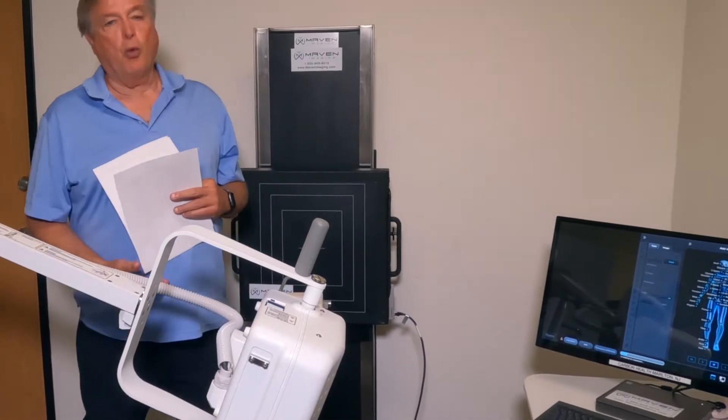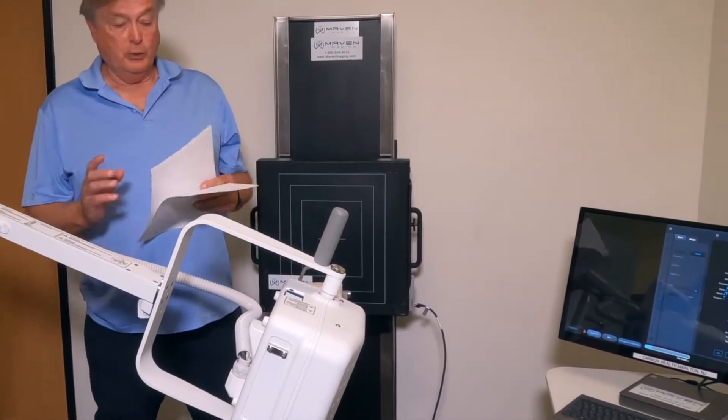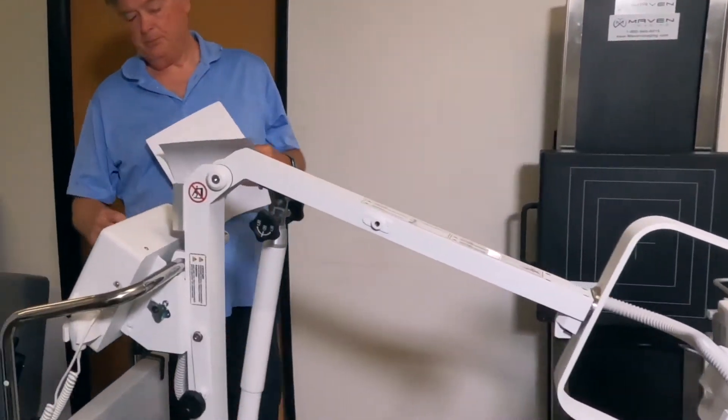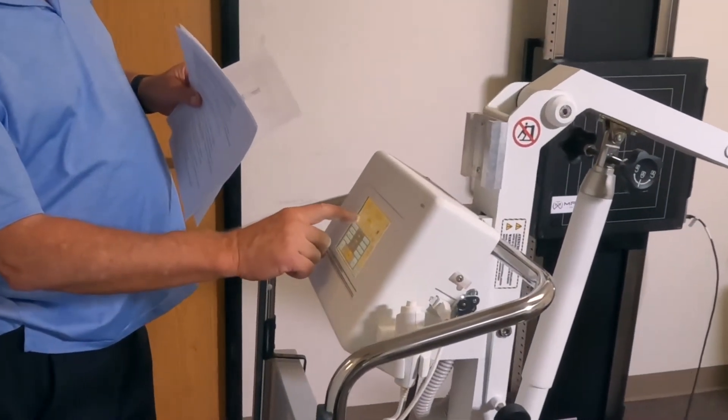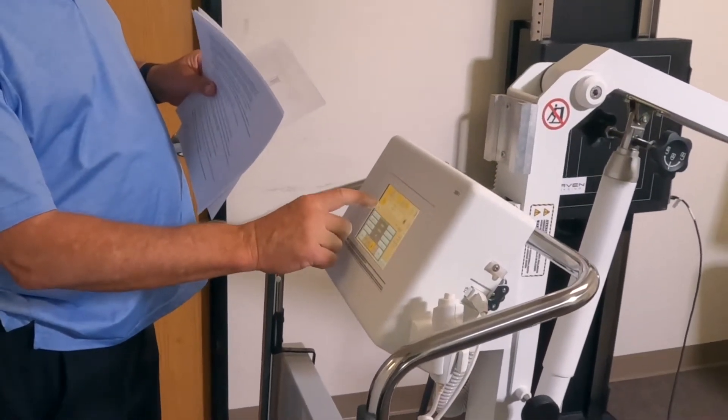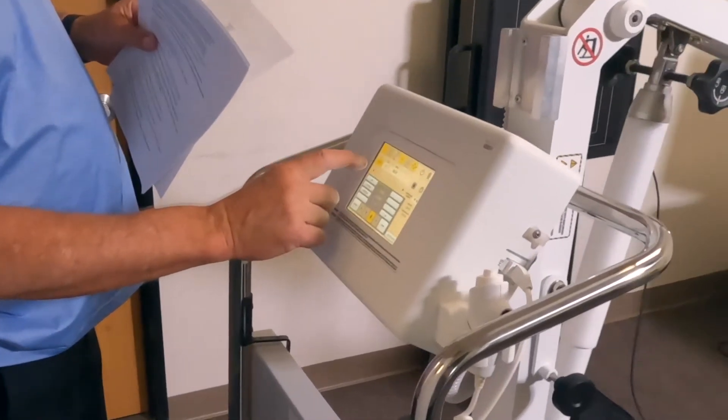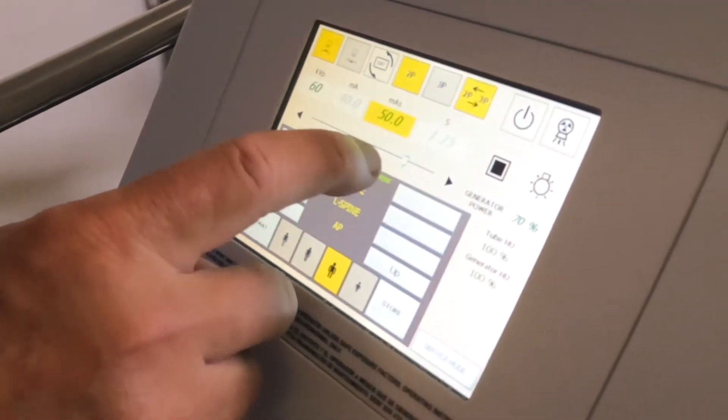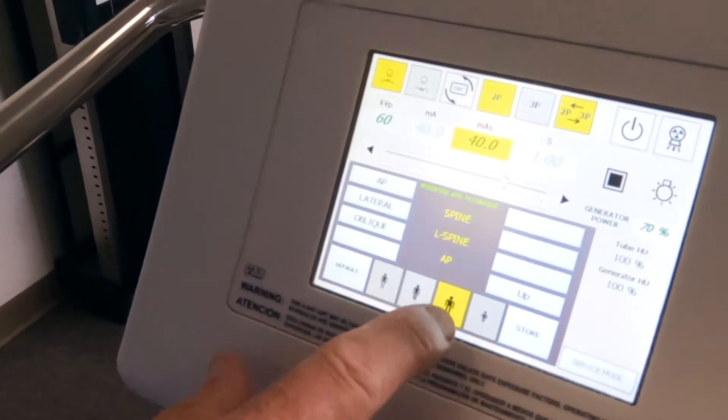The first thing we're going to do is warm up the Dragon for the first time use in the morning. What you need to do is come over to the console and change the KV setting to 60 and change the MAS to 40.